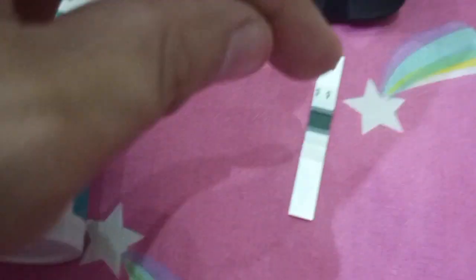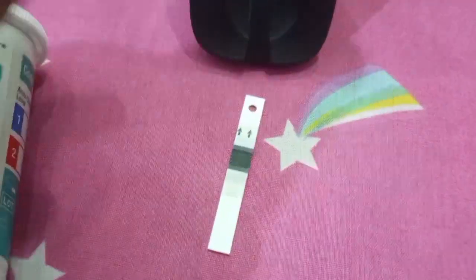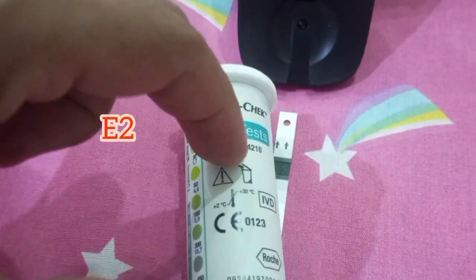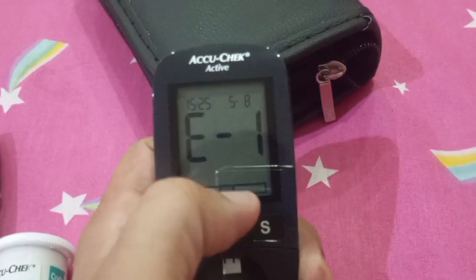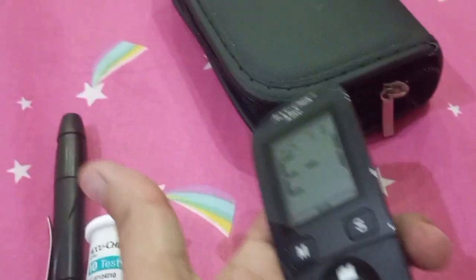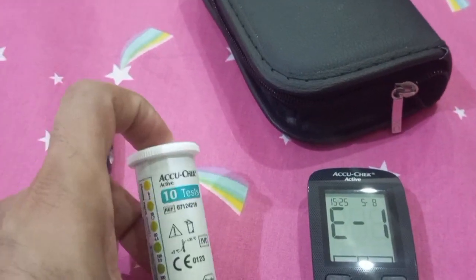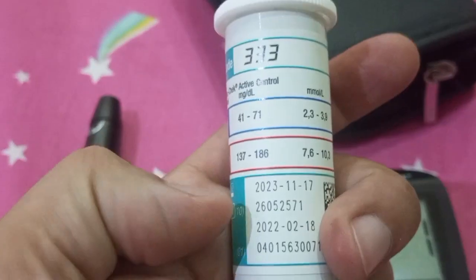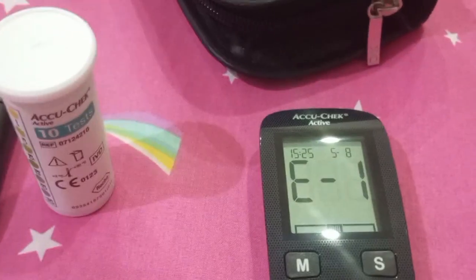A friend of mine told me he got the error E2. It simply means that after the blood sample was dropped on the strip, the strip reagent got wasted and the strip is now useless — you simply need to get a new strip. However, if the E2 error comes again and again, and the whole lot of your strips is giving the error, do check the expiry date on the strips and verify that you stored them adequately.